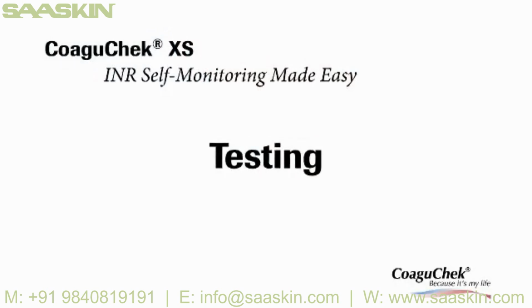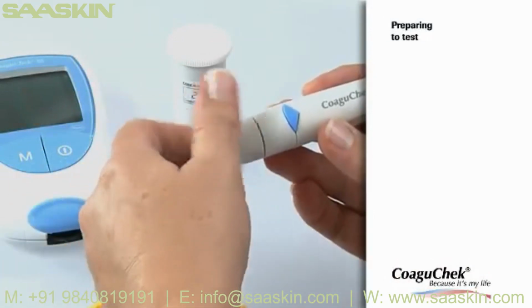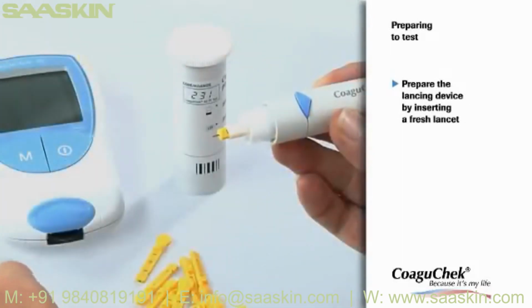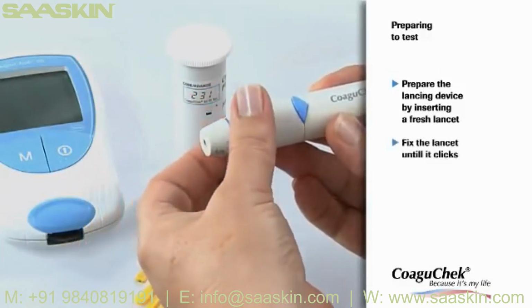Before you start testing, please wash your hands with soap and warm water and dry thoroughly. Now you are ready to prepare the lancing by inserting a fresh lancet into the lancing device. Fix the lancet and keep the device nearby.